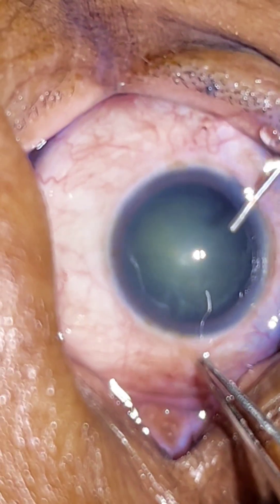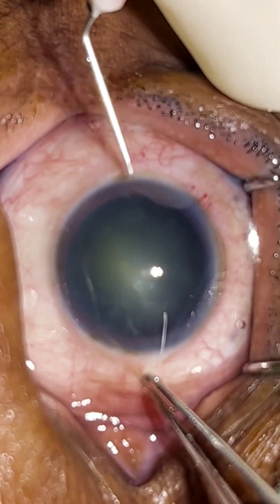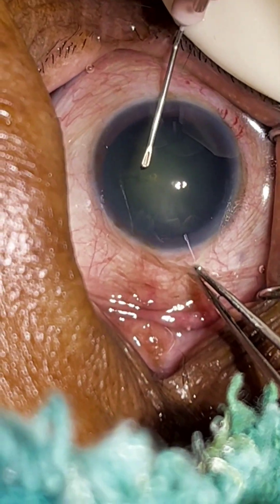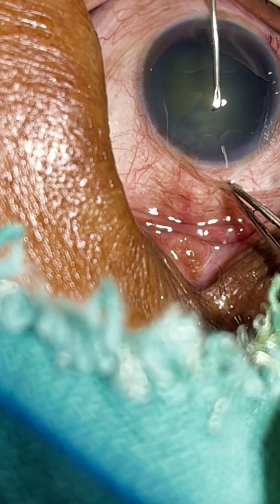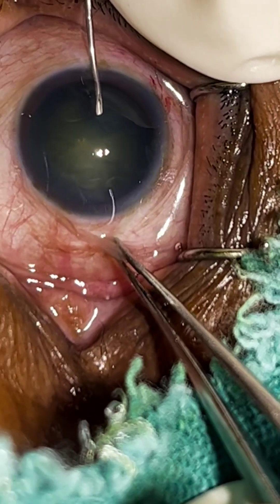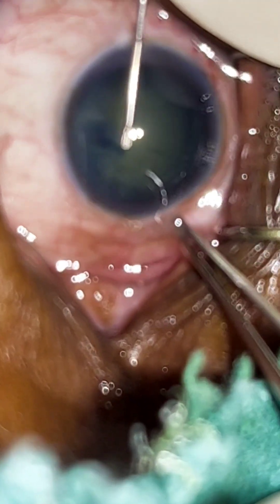Now injecting the viscoelastic substance, and I will go for the capsulorhexis. In phaco, a rhexis of 5 mm is the ideal size. For immature cases, if the nucleus is soft, the chance of extension to the periphery is high; if the nucleus is hard, the rhexis becomes easier.